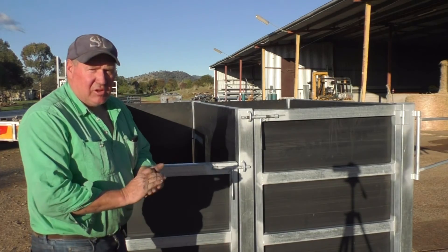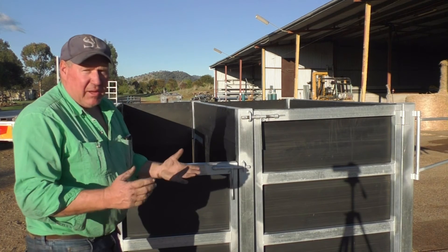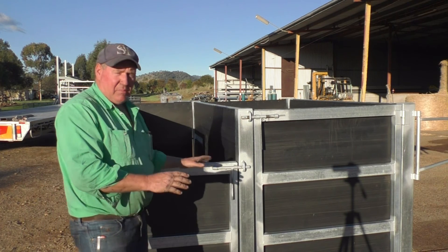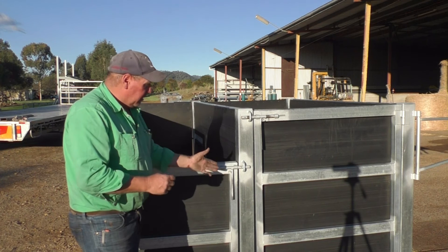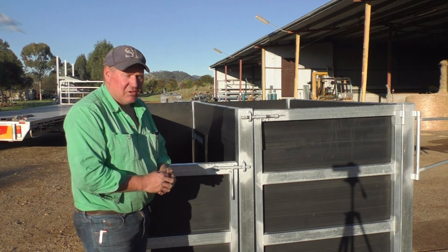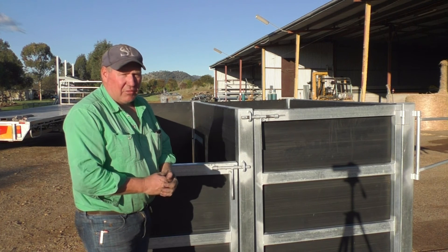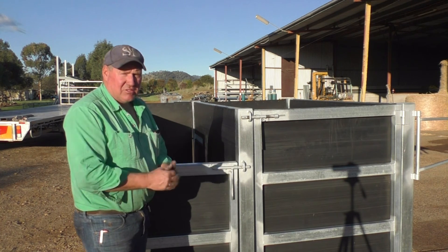Most of the crushes we sell come to you already made on a beam. So basically you unload it and sit it on the ground — this one's sitting at the moment, it's not bolted down. You just sit it down on the ground without bolting it straight into concrete and it's ready to use. You can even put it straight on the ground and put a few star pickets in on the dirt and use it straight away.